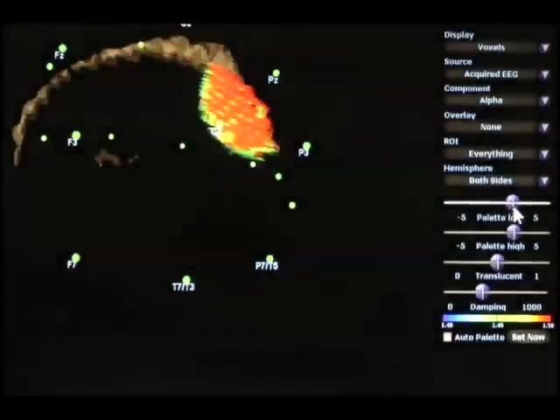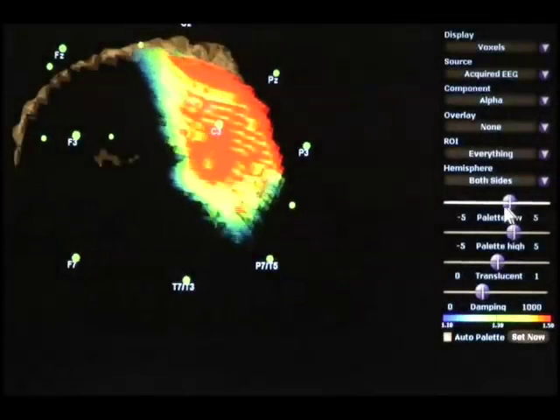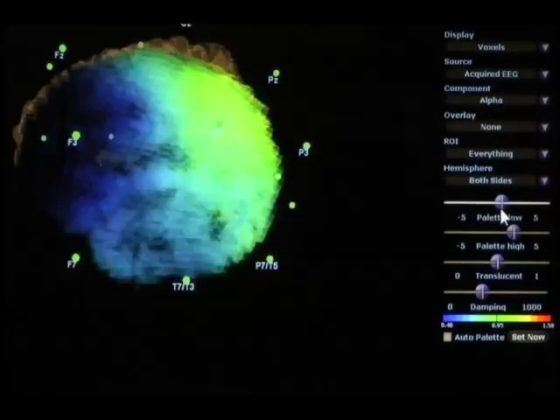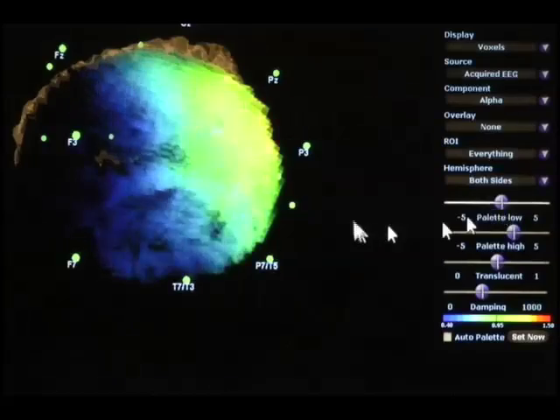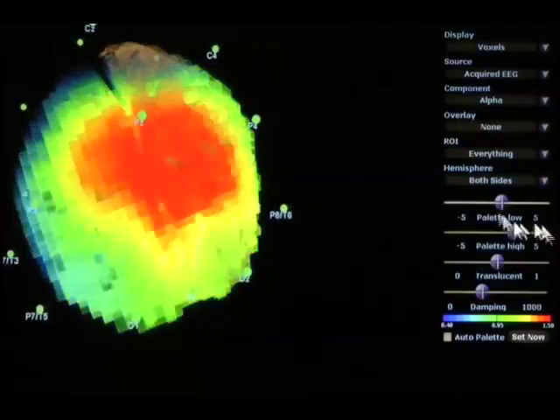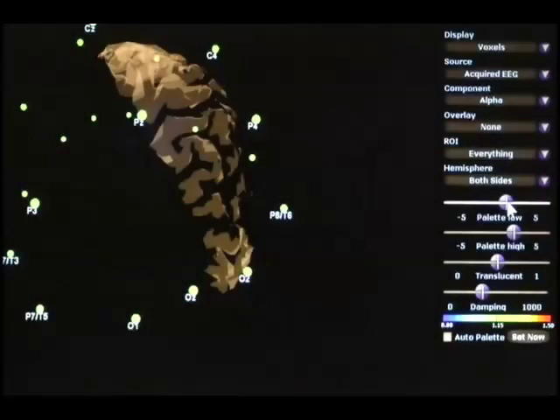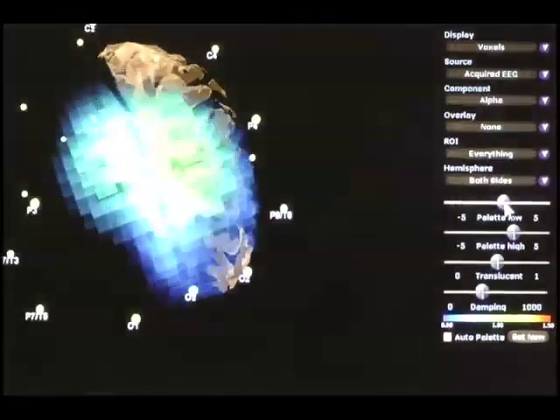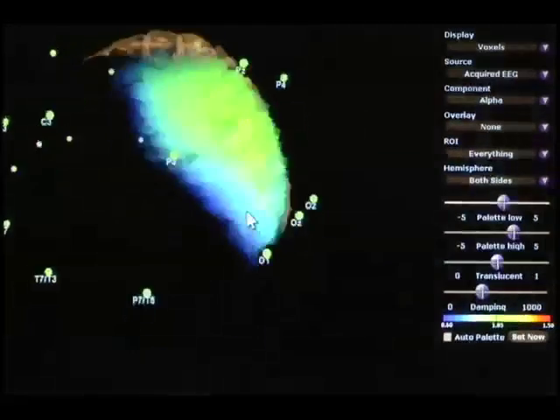These are very useful to adjust. Suppose I want to know precisely where to pinpoint a source. If I adjust palette high or palette low, you'll see I can limit the amount of region being lit up to a very focal area.